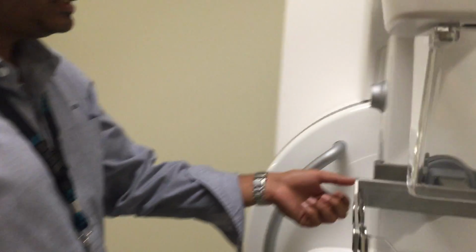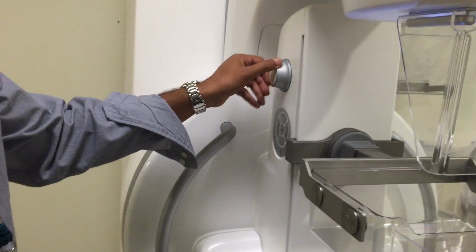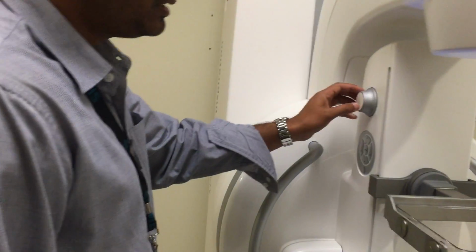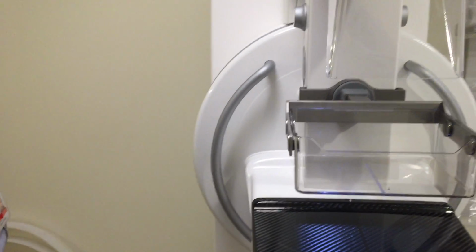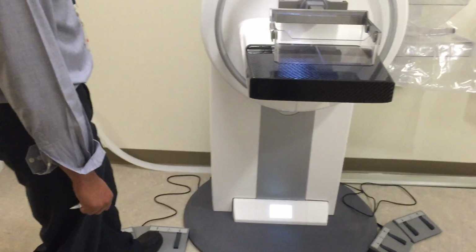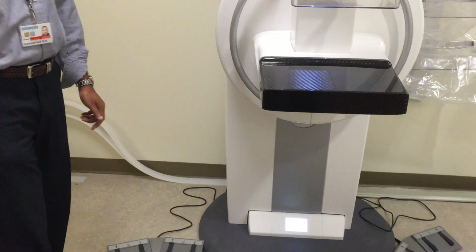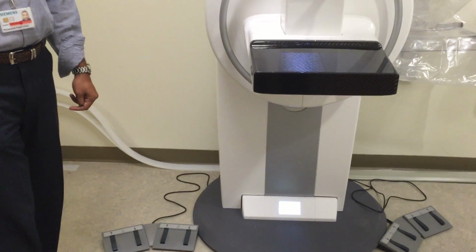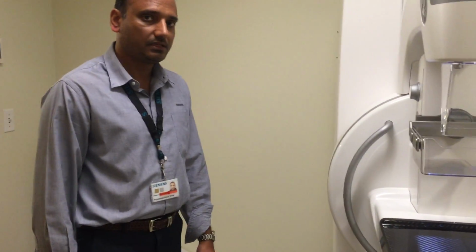Okay, I'm going to show you the compression going forward here. Oh, it's not working. And this is the compression control. Okay. And then we also have a compression control with the foot switch. Okay. Up and down. Is this optimal compression always on? Pretending the patient is there? Yeah. That's right. It's all automated compression.